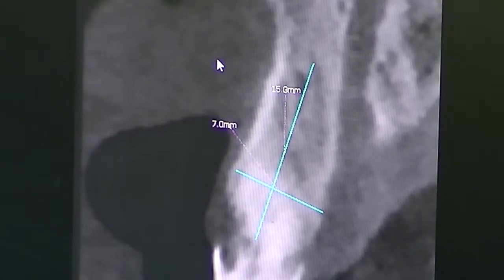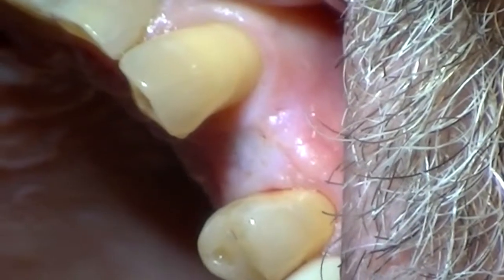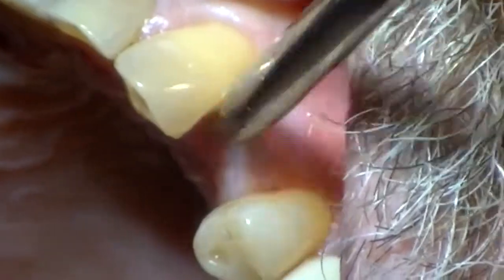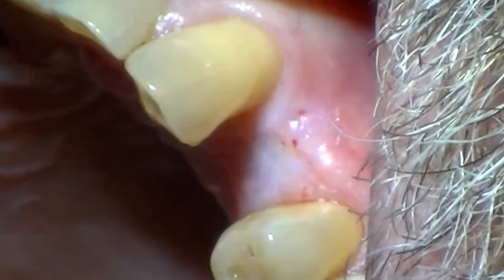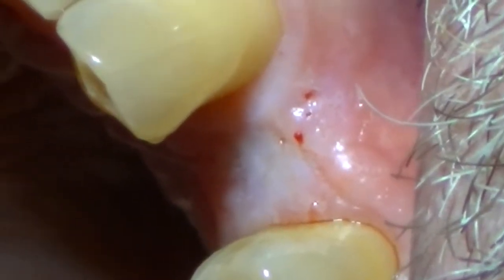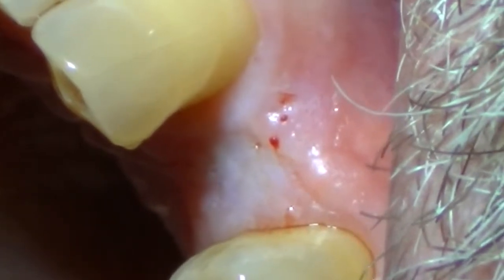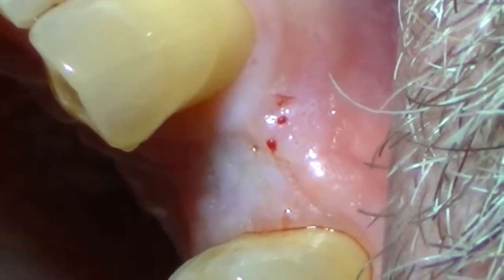But if we go intraorally now, and look at the available site, we can see we have a missing bicuspid tooth, and we basically are thinking tooth up in this situation. So we want to place the implant about half the diameter of that space. I would probably say a 3.5 diameter implant would be ideal in that situation.